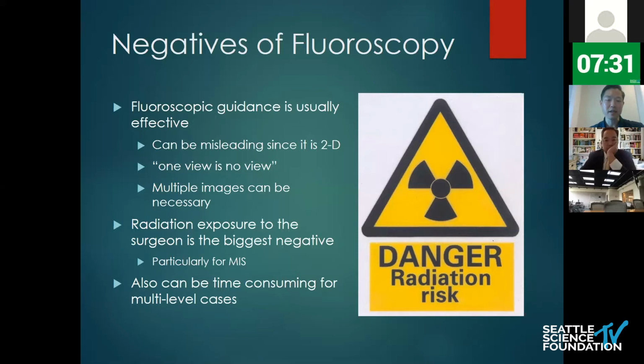And I think radiation exposure is actually a pretty profound occupational hazard for a surgeon. Other speakers have spoken to that, so I'm not going to dwell on it, but it's a real issue. Early on in my career, I did a lot of MIS surgery, a lot of percutaneous screws, a lot of multi-levels. I'd hit that 5-minute warning on that fluoroscopy, that beep, not infrequently. And at first, it didn't bother me, but as the years went by, it bothered me more and more. And multi-level procedures can be very time-consuming. So navigation will mitigate all that.